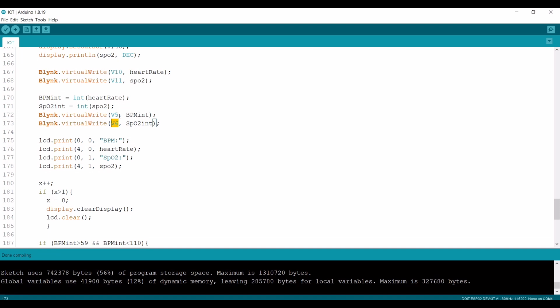And I need to create a new data stream here. As you can see, these two are different from this one, even though it's the same value, because it is a different data type. And here is to display on the LCD. I will display the heart rate and the SpO2 value. This one is to clear the display before printing a new value on the LCD.